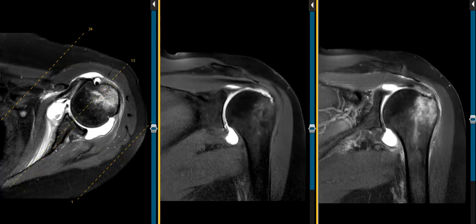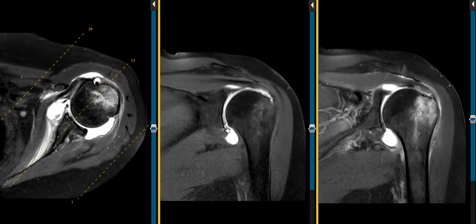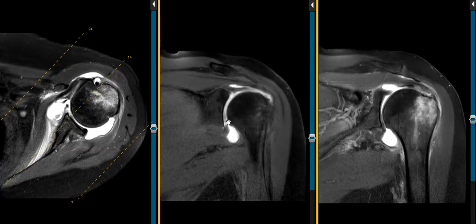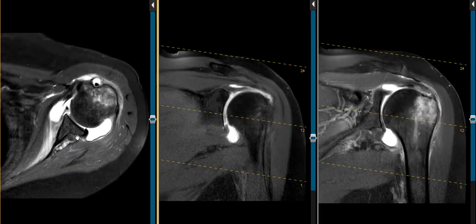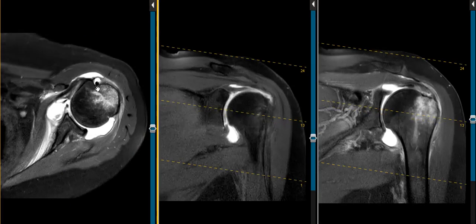Also we can see tears of the labrum better with arthrogram. In this patient they do have a tear of the labrum — the anterior and the inferior labrum. We see a little linear band of contrast right here, and we can see that a little bit better on this view.